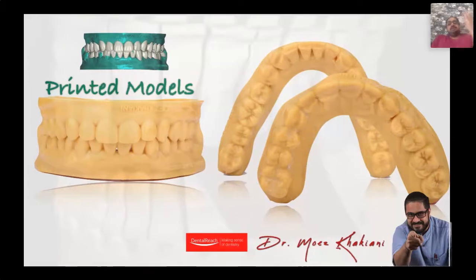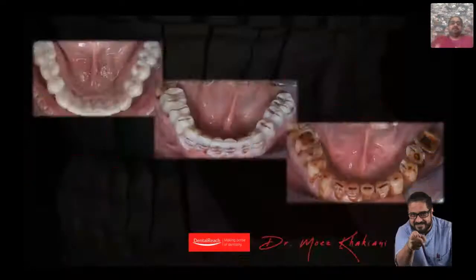What did I do? With these models, I made putty indices. With the putty indices, I did a test drive, and with the test drive, I went ahead and did my preparations. The top left picture is the mandibular test drive. The middle picture is where I have taken a bur and sunk it 1.5 millimeters on the buccal, 1 millimeter on the lingual cusps. Why? Because I want as much reduction. In the anteriors as well, I have used my PLV burs, the porcelain laminate veneer burs, to make depth grooves.